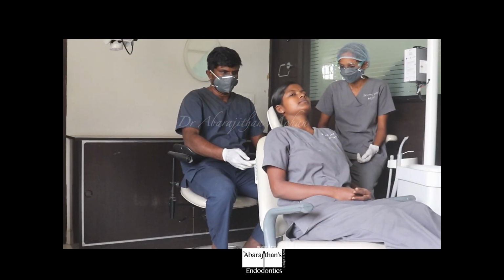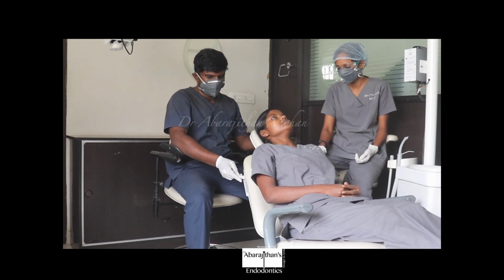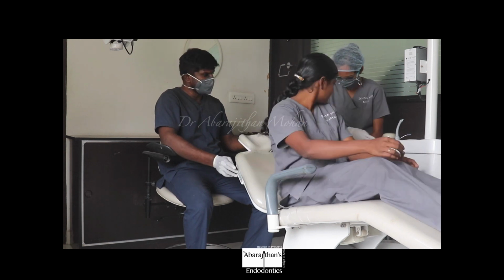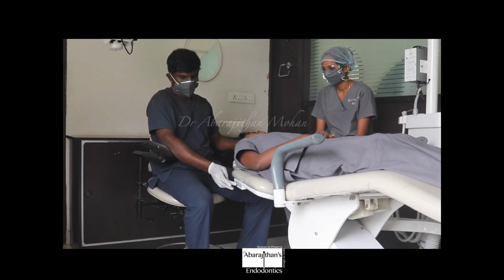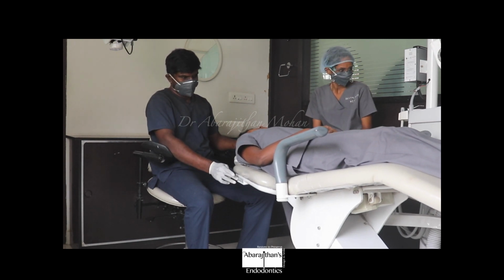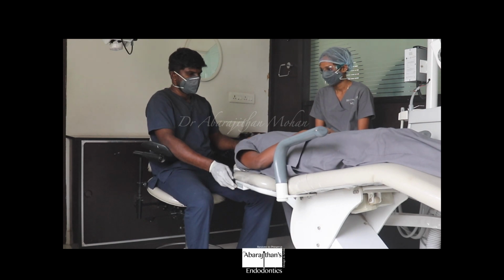So his thigh needs to be parallel to the floor, his back should be supported by the backrest. After the operator makes himself comfortable, the dental stool has to be adjusted according to the operator's comfortable position. Following this, the patient's position or the patient chair is adjusted. So for best ergonomics and for using magnification, the patient is always put in a complete supine or a flat position. The height of the patient positioning is determined by the comfort of the operator.